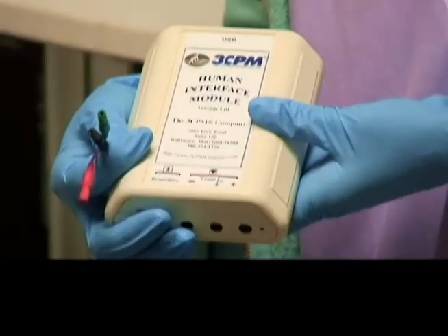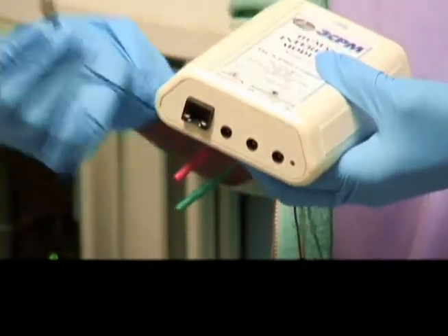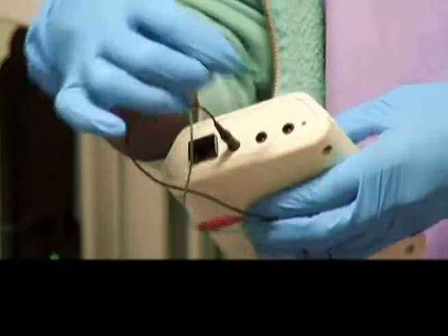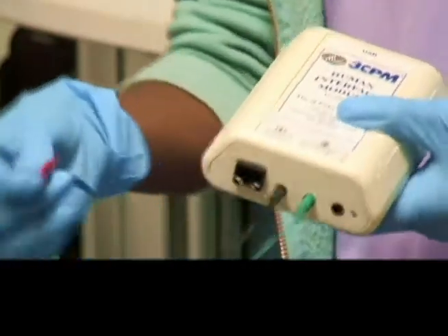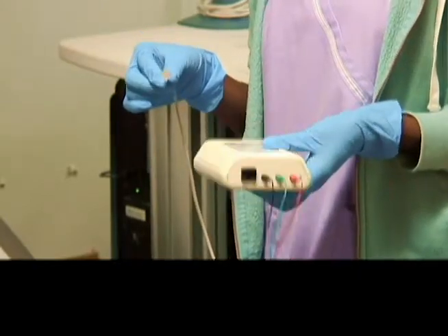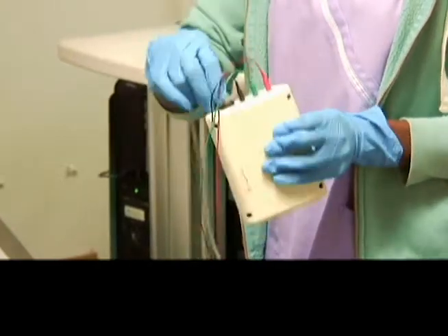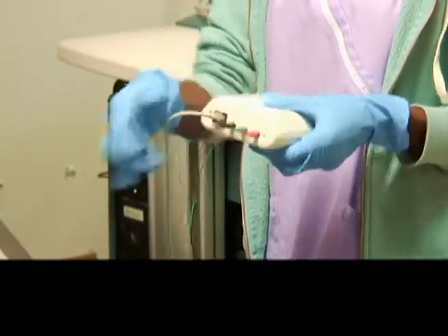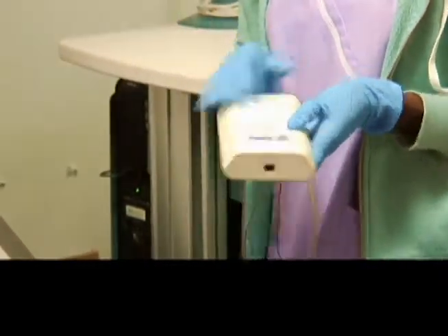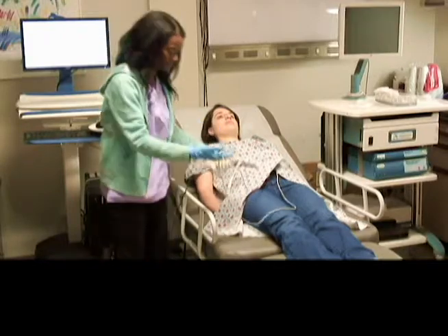So we've got everything color coordinated here. We've got our black lead, which plugs in to the black. Got our green to green, and our red to red. Next, we're going to connect our respiratory belt to the module, just like so, just like a phone cord. Lastly, we are going to connect the computer to the module. Next, we're going to place the module in a secure place where it's flat and it won't be disturbed.